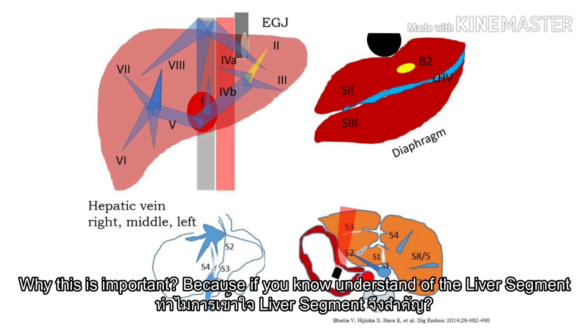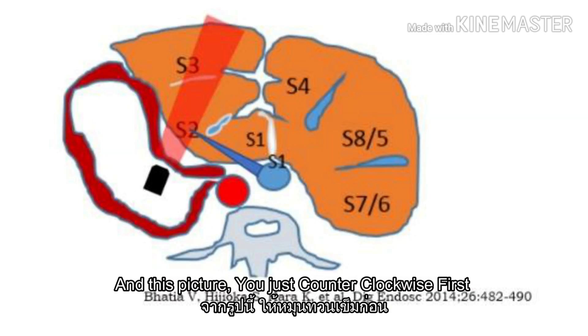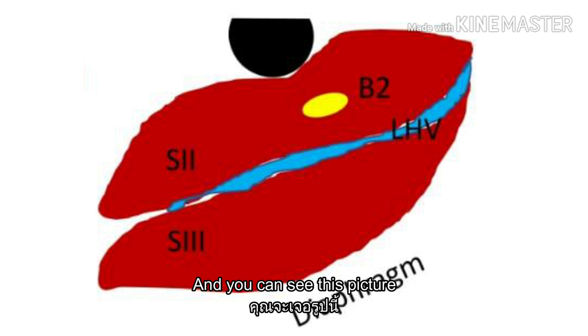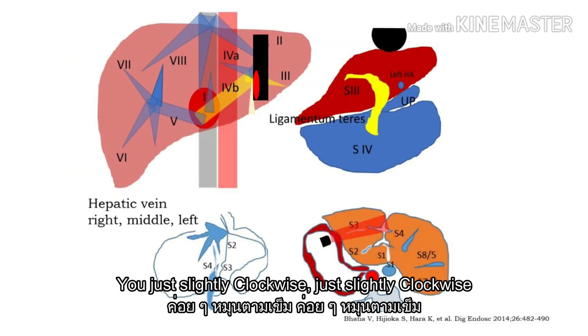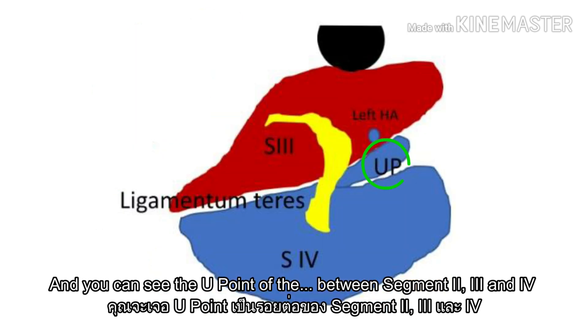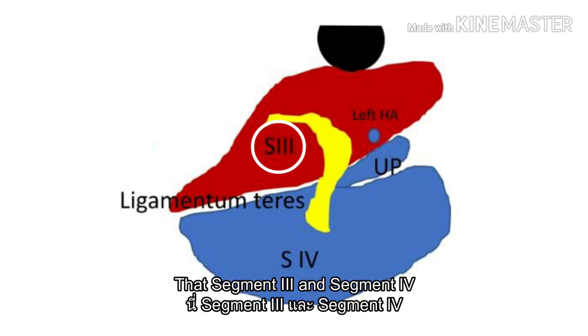Why is this important? Because if you don't understand the liver segments, it will not be easy for you to perform EUS-BD in the future. In this picture, you just clockwise first and you can see this picture. Then you rotate back and clockwise from segment 2, 3, and the left hepatic vein — just slightly clockwise. You can see the boundary point between segments 2, 3, and 4, then S3 and S4.